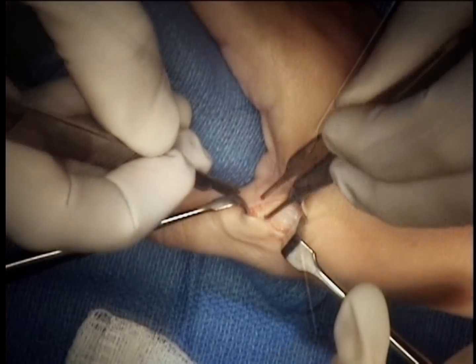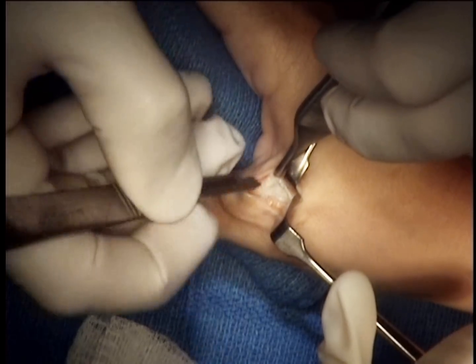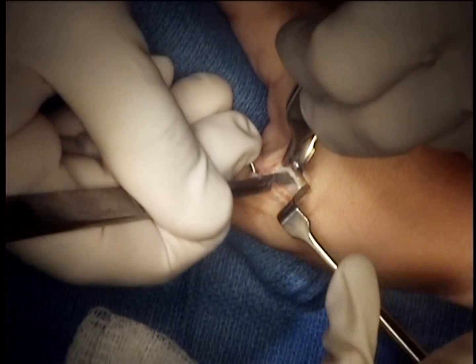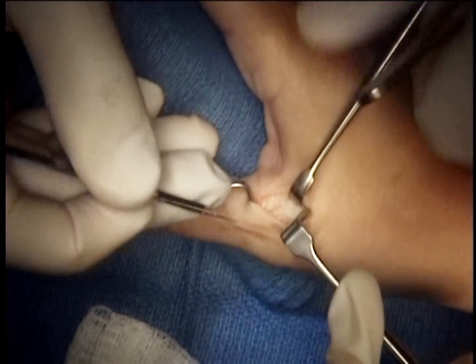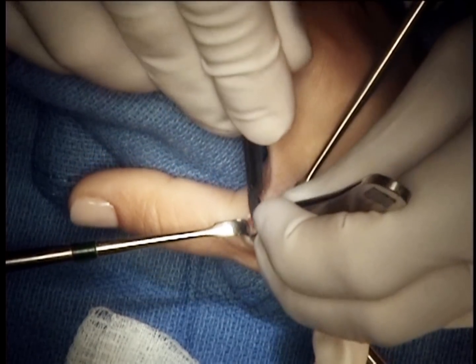As we divide the aponeurosis, we note that it is markedly adhered to the underlying ligament, and careful tenolysis is necessary at this stage in order to free up the tissues from the critical collateral ligament.